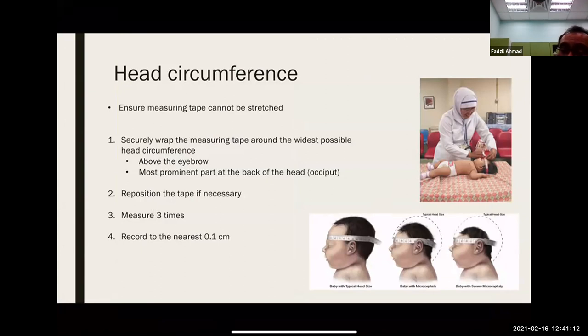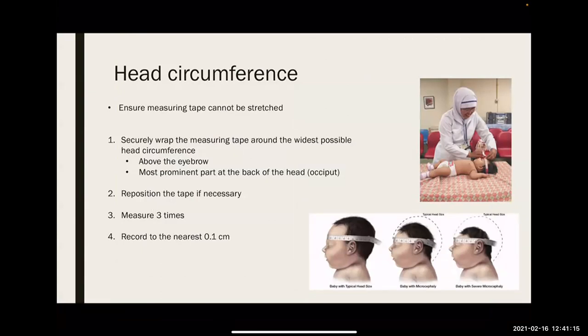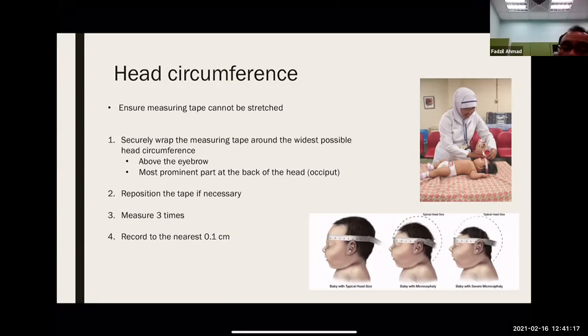That's where you put the tip there, and then you measure, and you see the technique is wrong. The lower one is because you put it at the back here, and you measure up here, not measure at the back up here. Understand? It's reversed. Many of you measure here. You have to put here and measure here, not here. Measurement is here.